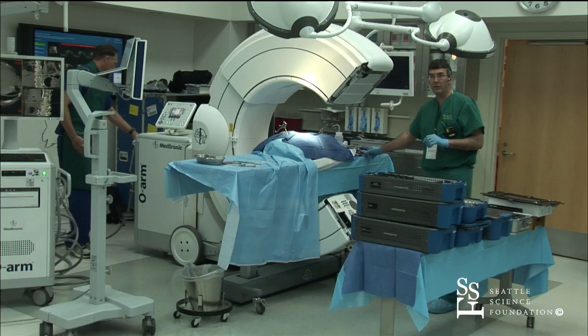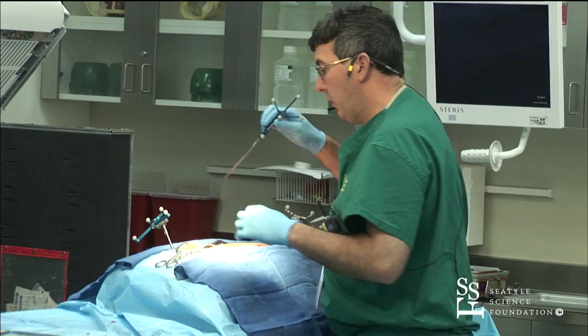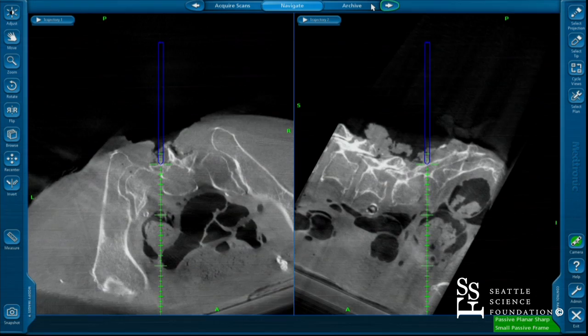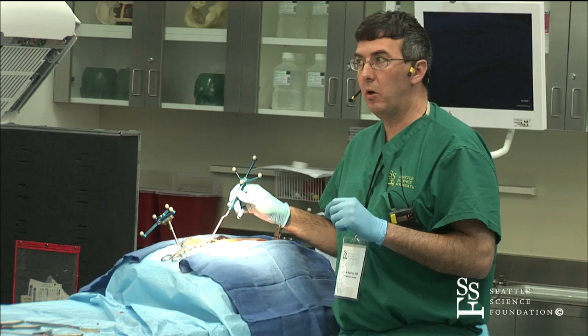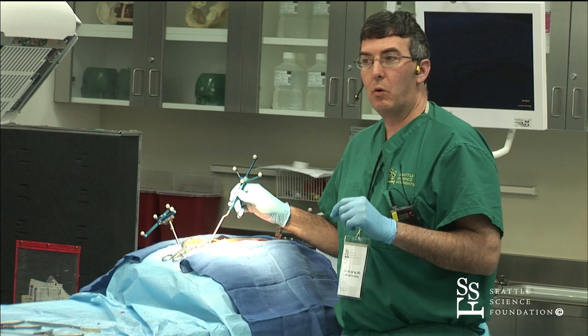And the first thing you do is you go, I hope I put the marker in a place I won't hit it. What we try to do is make sure I am in the right place, because again, you've got to remember: the system's only as smart as the person using it. I work with a couple of people and they have a real hard time using navigation because they push the body and you lose your reference point, and so things are off.